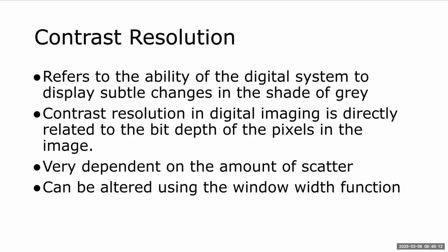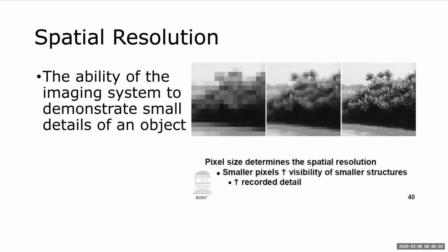So just very similar to your phones. You can adjust the way it displays on your phone. You can adjust the brightness. You can adjust the contrast, just as you can also do on television sets.